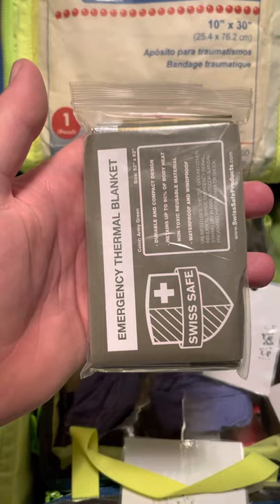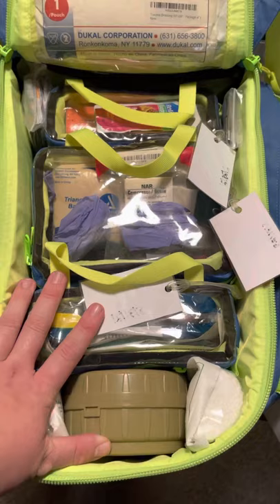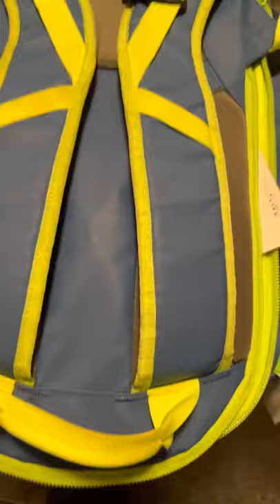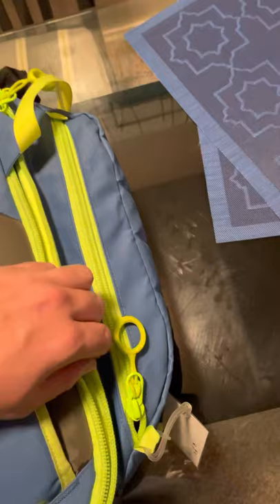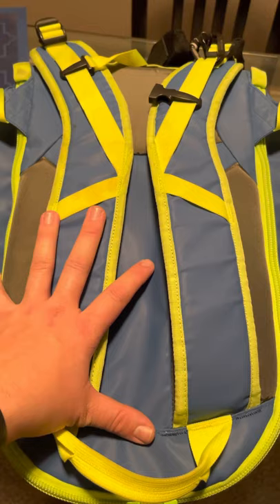That basically rounds out my oh shit kit. If you have any questions about any of the products, please let me know — I've also posted a list of everything in the kit. Emergency oxygen is in a separate bag that contains the oxygen tank, as well as oxygen delivery devices: nasal cannulas, non-rebreather masks, and things of that nature. Remember to only use tools and techniques that you've been properly trained in, that fall within your scope of practice, and that you have standing orders for. If you have any questions, let me know.